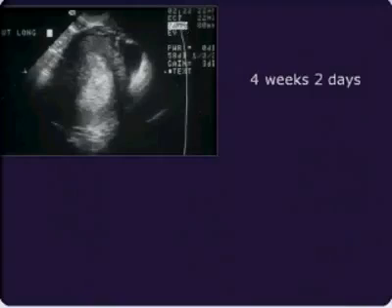So the resident scans her, and resident number 1 I actually think has a difficult decision here because we have this decidual reaction of the endometrium. We have some free fluid, but we don't see a sac. This absolutely could be an ectopic, and it clearly needs to be correlated with what the HCG is at this point and with her physical symptoms. So at this point, by imaging, we can't tell intrauterine pregnancy from ectopic.